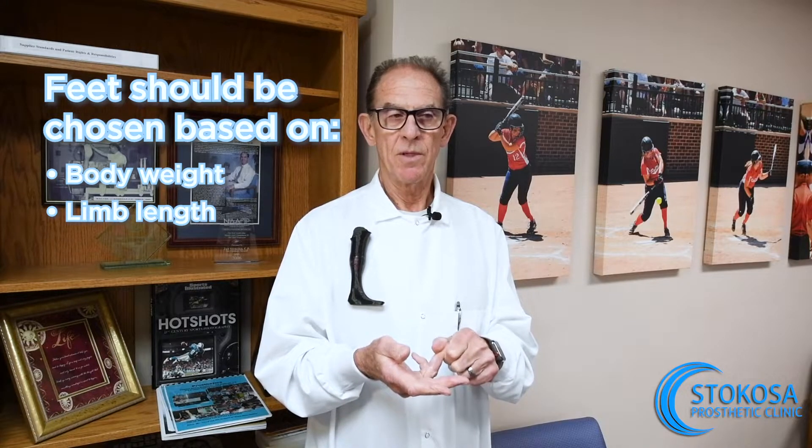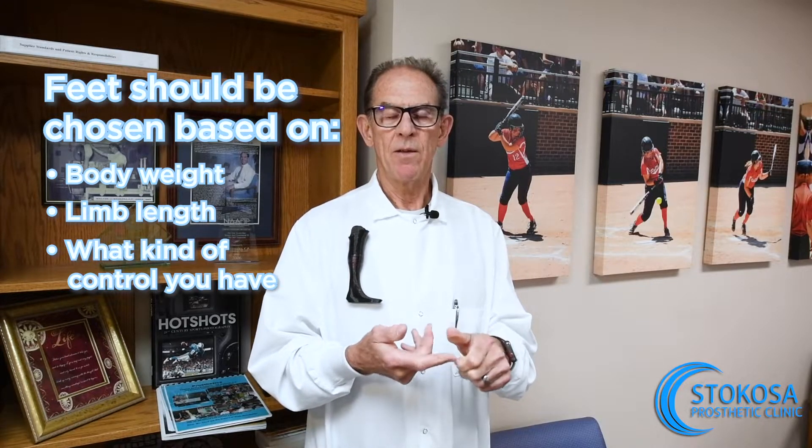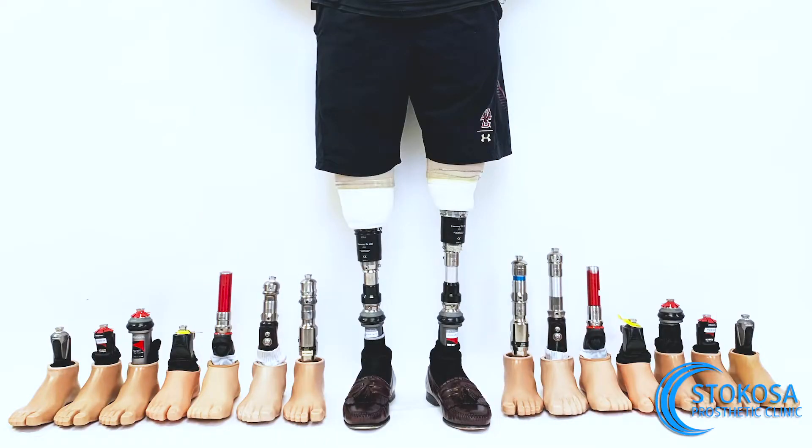Based on how long your limb is, what kind of control you have, and what your activity level is, we're going to pick several feet — perhaps five or six or more — and you will be able to walk on them and evaluate them, whether it's just in the clinic or whether you're going to go home and perform that particular activity. Then you wear one for two to four days, get another foot, and do that comparison. Through a process of elimination, we'll ultimately get the foot that you feel is the best for you.